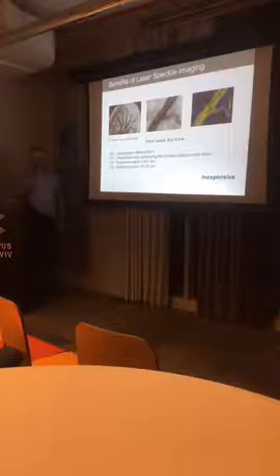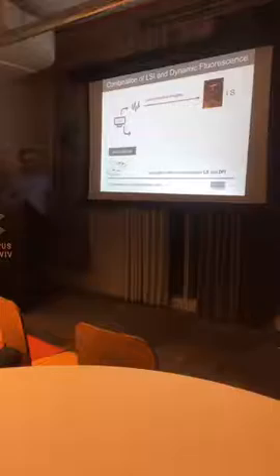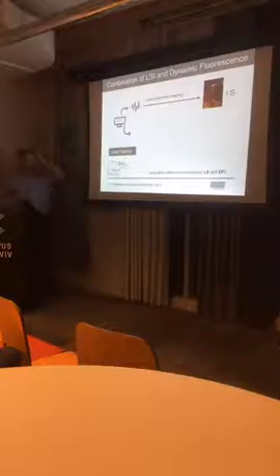But we not only use this technique. We also use a combination of this laser speckle with fluorescence. I would now like to show you what we can do using this laser speckle with an intact cranium, so we still can see the blood vessels through the intact cranium, and of course we're talking about mouse.